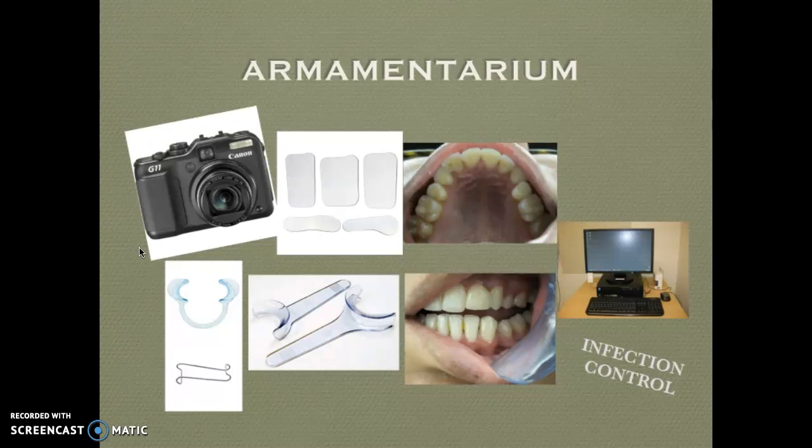And that really deals with the inner workings of the camera, how it acquires an image. And these cameras are very light. So if you're working by yourself in obtaining these images, you can handle and operate this camera with one hand. There's also some special lenses for dental photography as well as lighting with this particular camera.